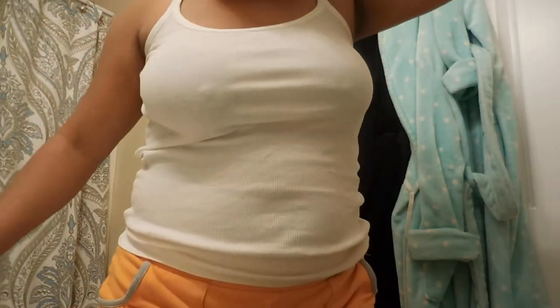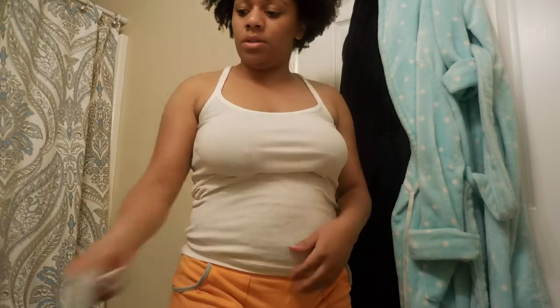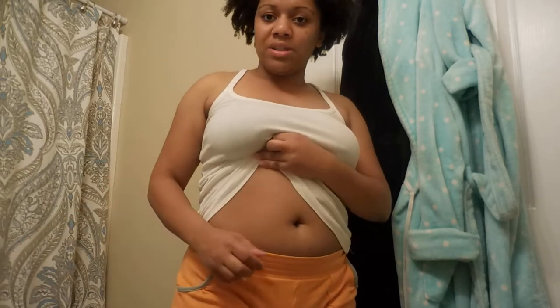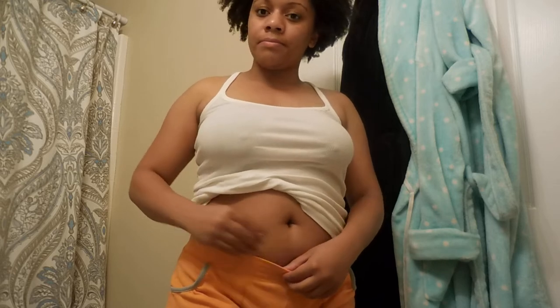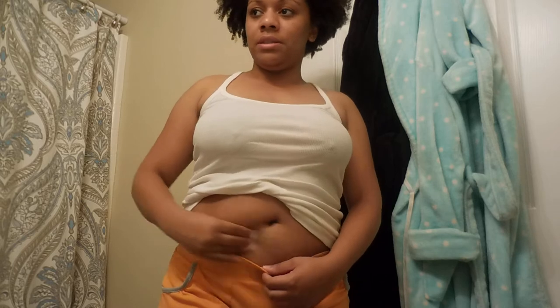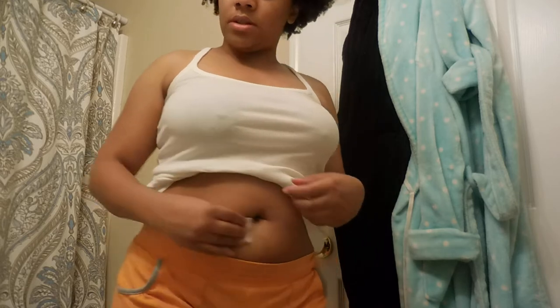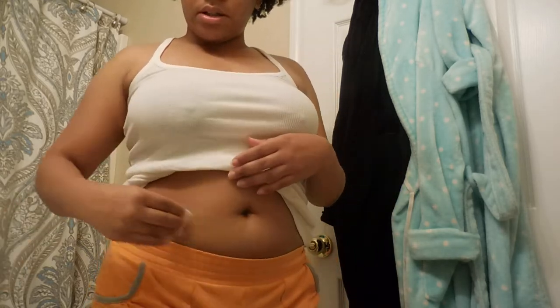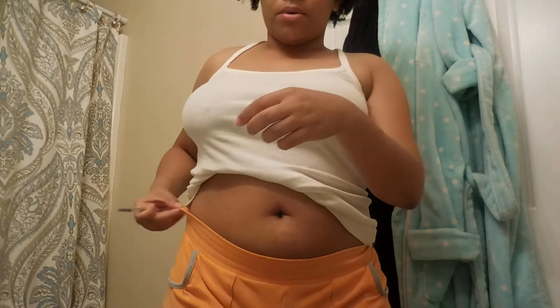I don't have my bed or anything this time, I just have my alcohol. I already washed my hands. So excuse my big belly and my night tools. I'm just going to wipe that clean and let it dry. I'm not whispering for any reason — there's nobody sleep, my husband is downstairs watching TV. I just got out of the shower, so I'm going to let that dry and take my cap off my needle.